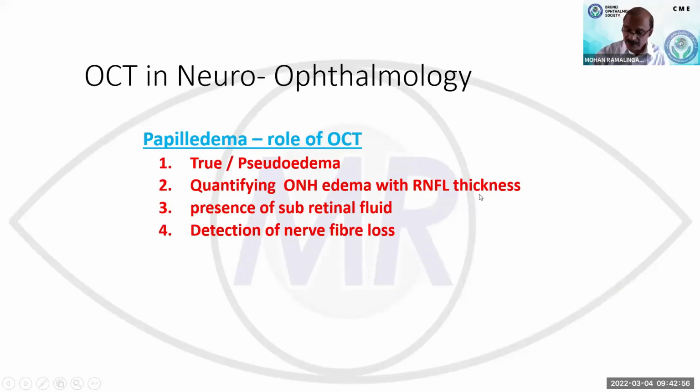And of course, for our neurosurgery colleagues, papilledema: the role of OCT to differentiate between true and pseudo papilledema, and quantifying the papilledema, and to document the other causes of visual loss in papilledema, maybe presence of subretinal fluid, the detection of the nerve fiber layer loss.